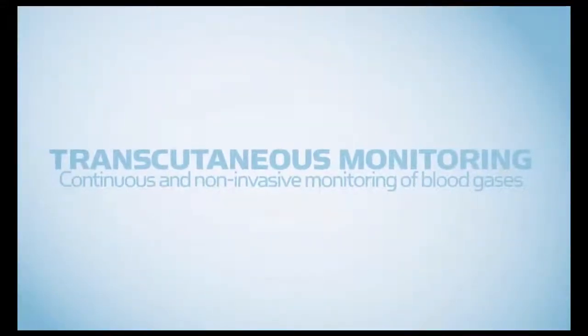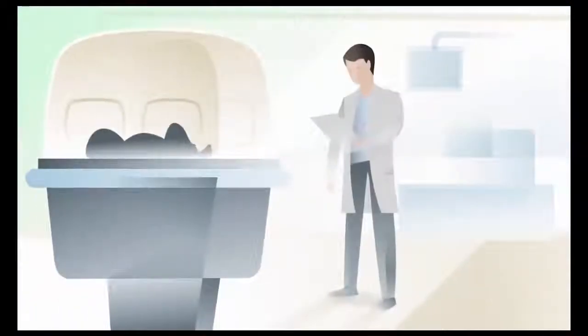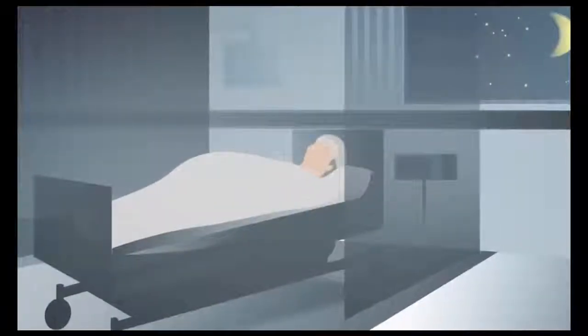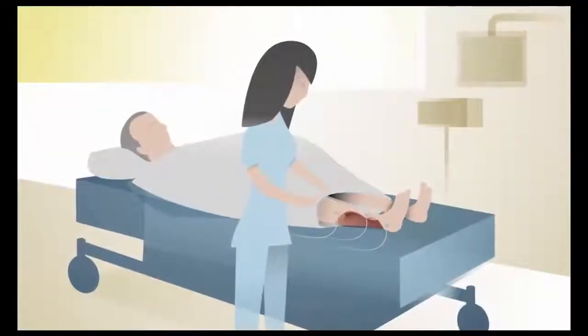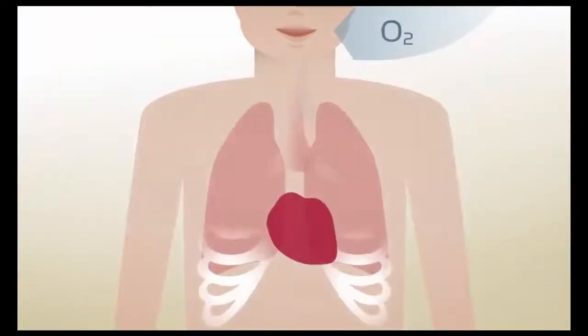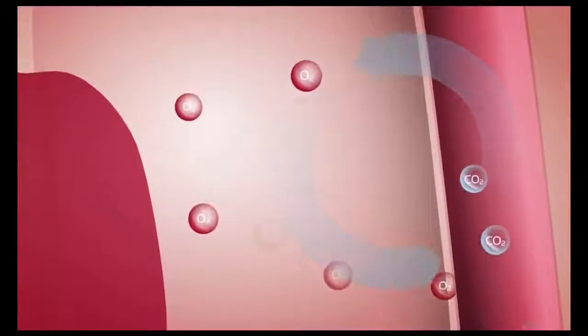Continuous and non-invasive monitoring of blood gases. Transcutaneous monitoring provides critical data about a patient's ventilation and oxygenation status when frequent invasive blood sampling is not adequate. When you breathe, oxygen is transported from the air into your blood vessels via the lungs, and carbon dioxide is released.